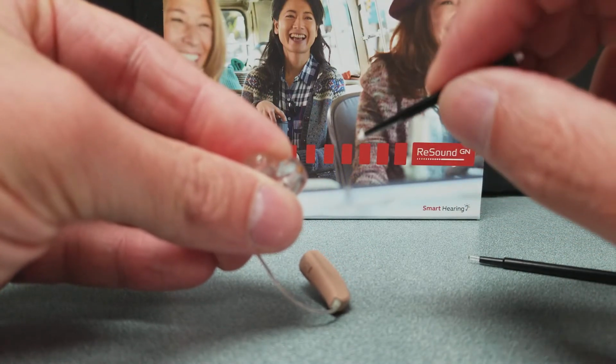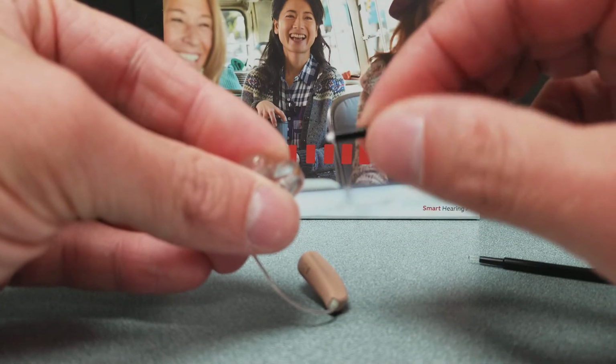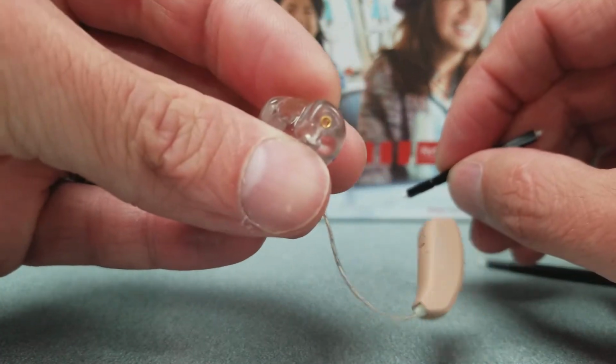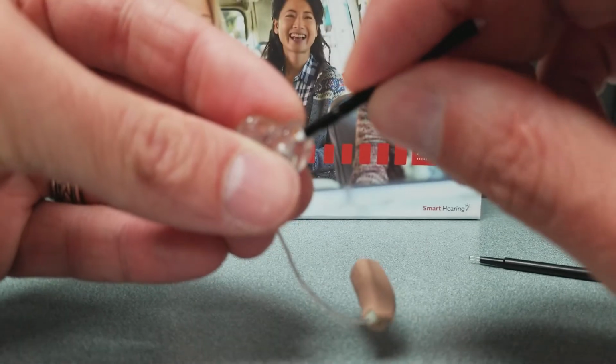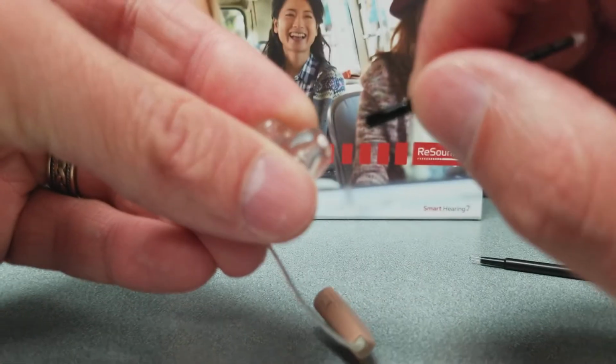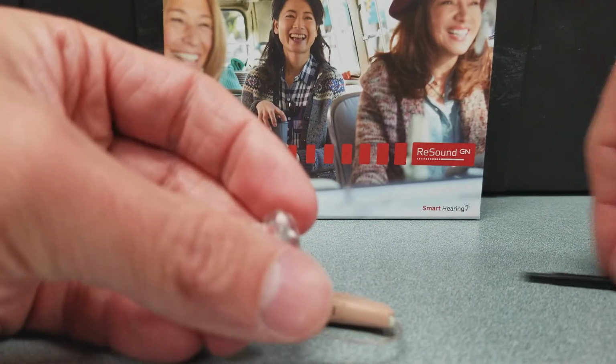That removes it. You're then going to flip the stick over. You're going to notice it's the proper side because it's completely circular. You're going to screw it into the center of that little ring, just like so. Twist and push. It has seated itself, and then you can pull it out. And there you go. That's that replacement.